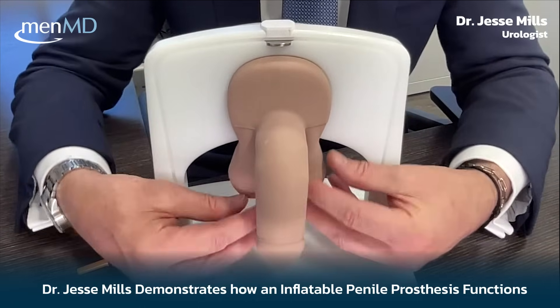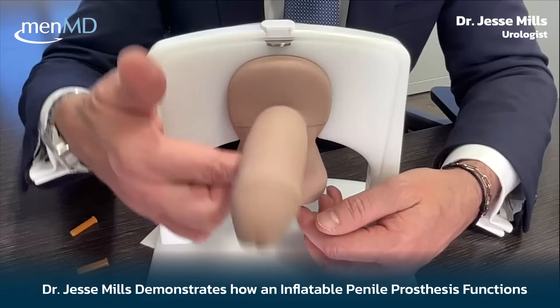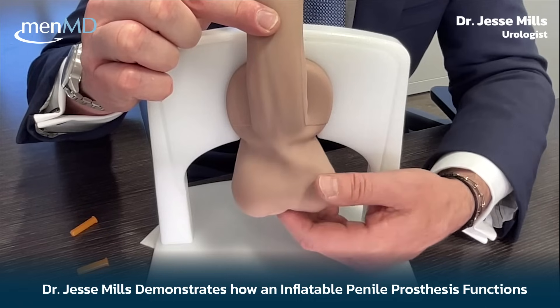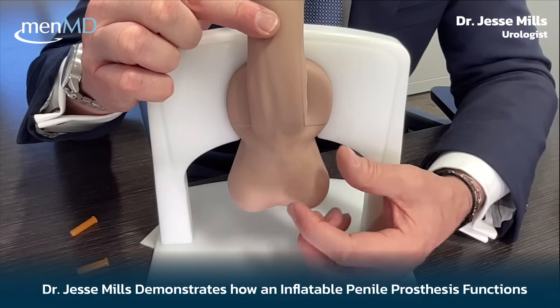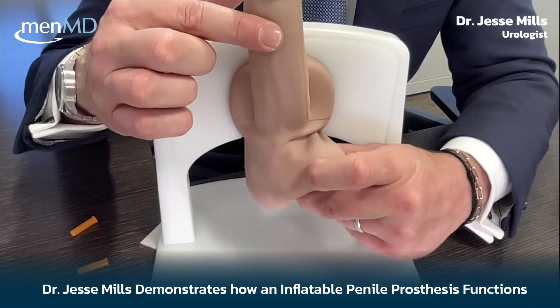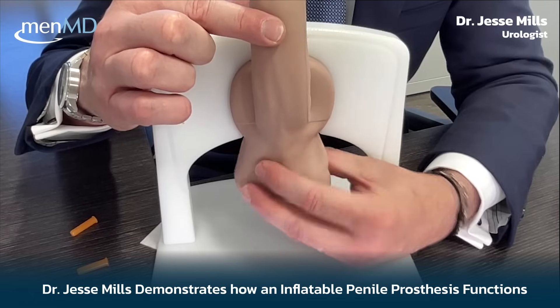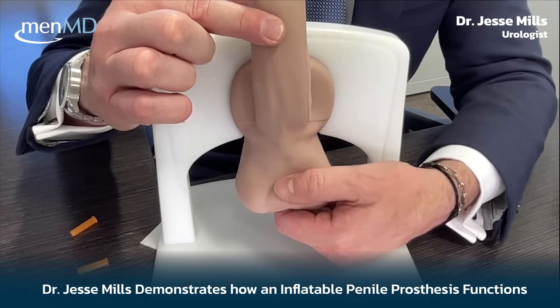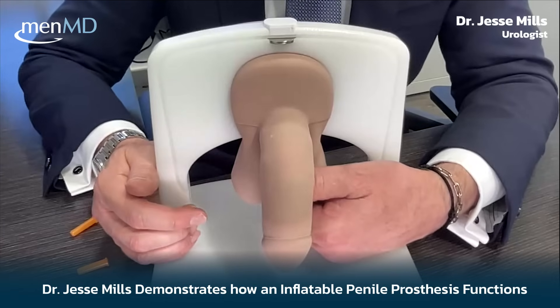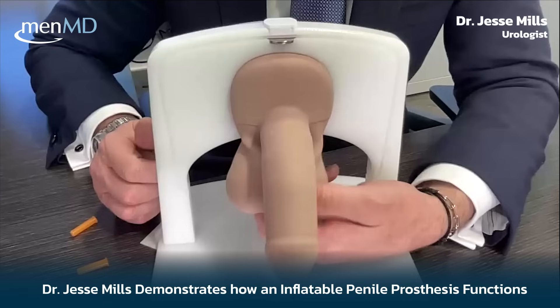The implant is fully in place and flaccid. This model has two testicles, just as most men do, and most implanters will place the pump right between the two testicles. You really don't see where that pump is, which is good — it's discreet, so you don't have to let anybody know you have a penile implant. If you really tighten up the scrotum and push it forward, you can see it here. It's smaller than a testicle, about the size of my thumb. This is all you need to think about when it's time to inflate your prosthesis. The reservoir is sitting up here, essentially at bladder level.